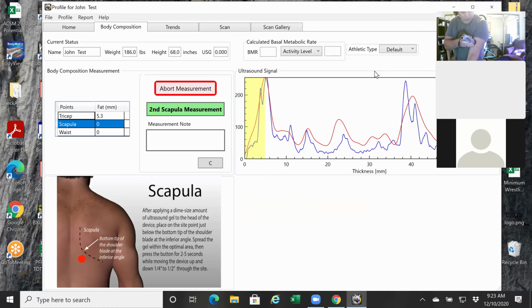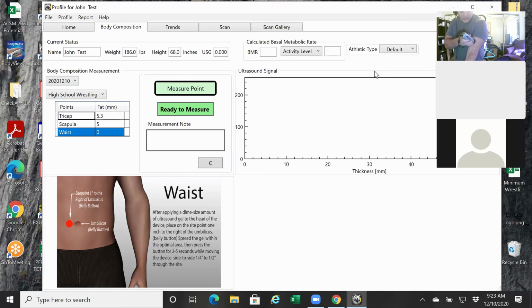We'll repeat that. It's just a nice, comfortable, fluid speed through the point, okay? And in this case, it asked for 2 readings. Now note, I'm not trying to toot my horn, but note that the measurements are super close together. We're talking like 0.3 of a millimeter. It's like trying to split a hair, just to show you the accuracy and repeatability, I guess, of the system.